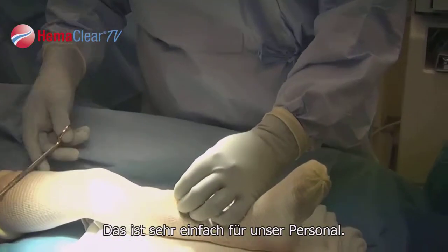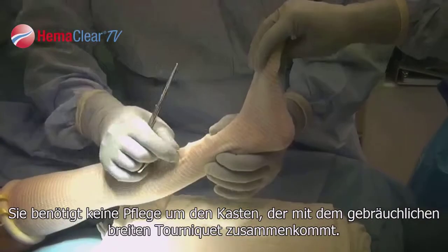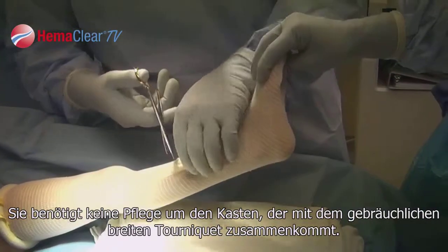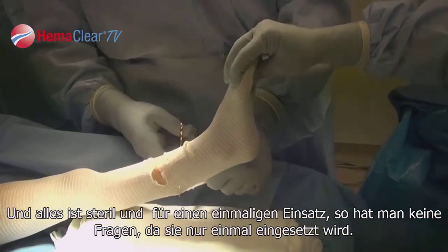It's very simple for our staff. There's no maintenance of the box that comes with a regular wide tourniquet, and everything is sterile, single-use. There's no question that it's been used only once.